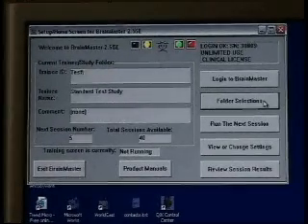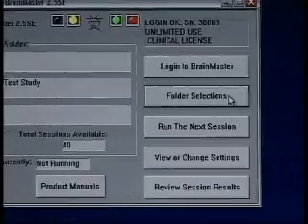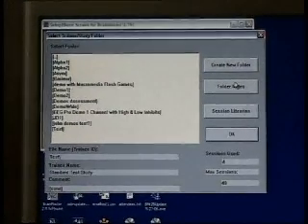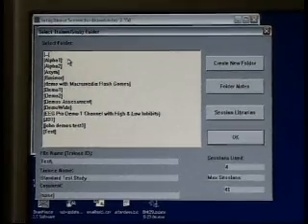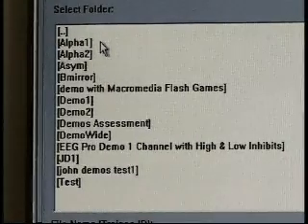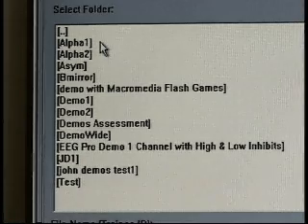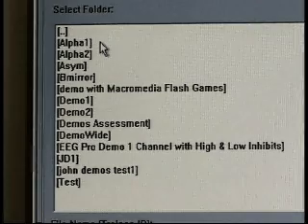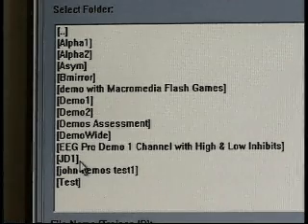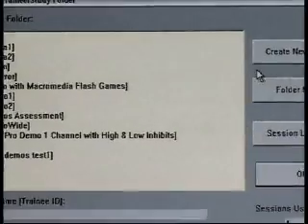Our next step will be to simply enter our first client folder. We click the folder selections box and then we notice that our select trainee study folder box appears. As we look down the list towards the left we see some built-in protocols. Your list may be slightly different but you should see Alpha 1, Alpha 2, Asym, Demo with Macromedia Flash games and so on. As we populate this list with additional clients their names will begin to appear. JD1 for instance happens to be a client folder, but this list will grow and become a library of your client folders.